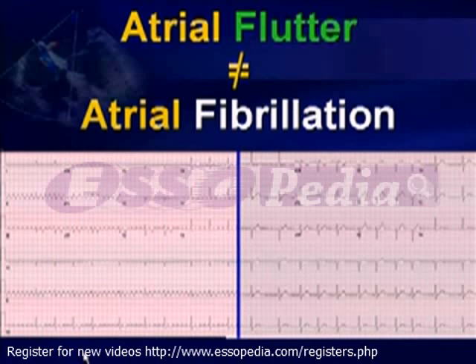So our PA pressure calculation from the TR velocity may be the best indicator of increased LV filling pressure in the absence of lung disease. Perhaps similar comments can be made to those individuals with new onset or "coarse" atrial fibrillation, which may resemble atrial flutter.